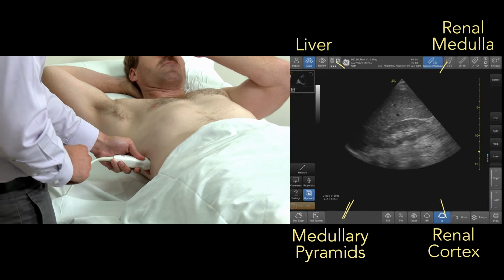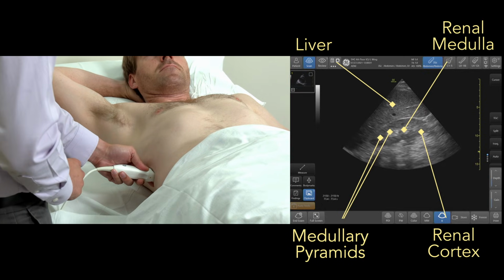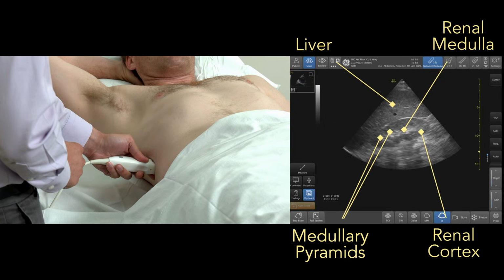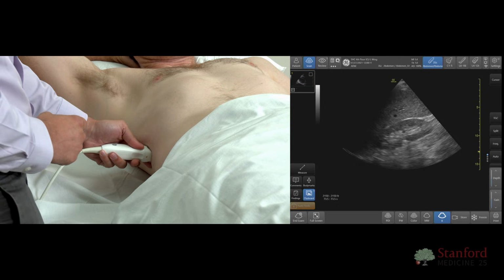Here we can see the renal anatomy. On the top of the image, we see the liver. Between the liver and kidney is Morrison's pouch. The kidney here, we can see the cortex, the medulla, and the medullary pyramids. In some patients, you may also see cysts, which are generally more towards the periphery.